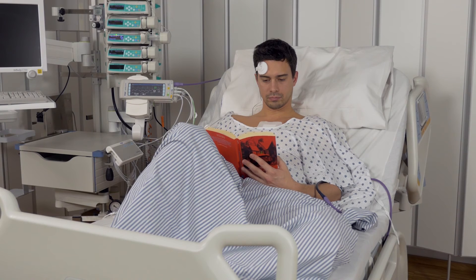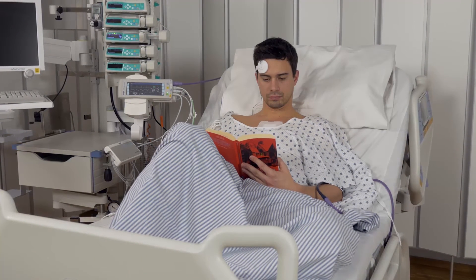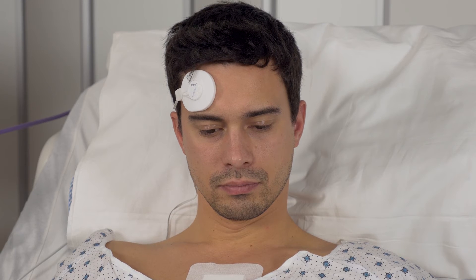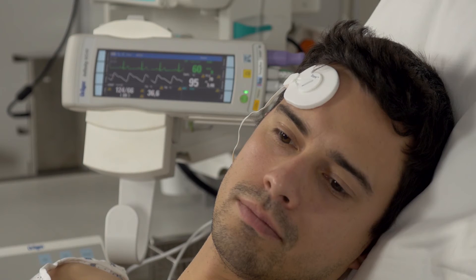Used in intensive care units, the T-core sensor continuously measures the temperature as an alternative to invasive measurement methods. The extremely light sensor cable increases wearing comfort for the patient as well.